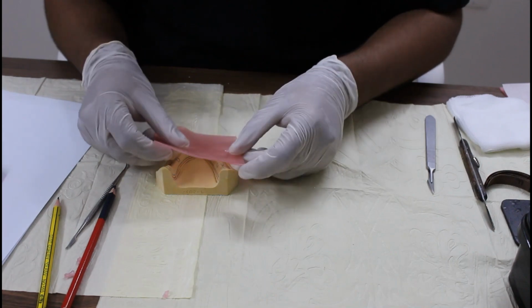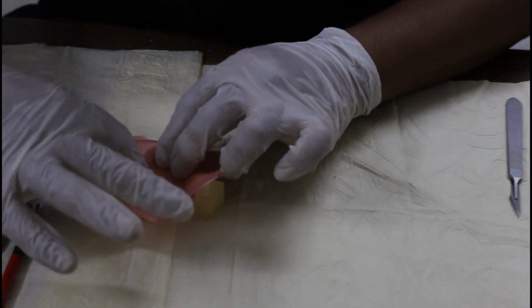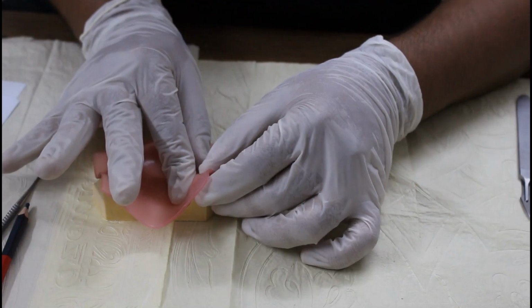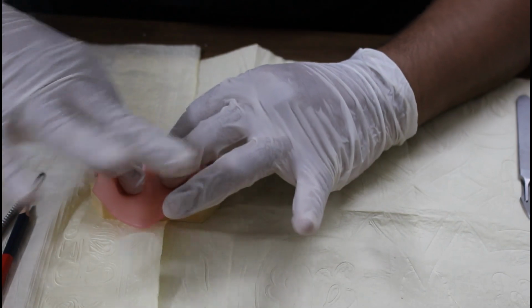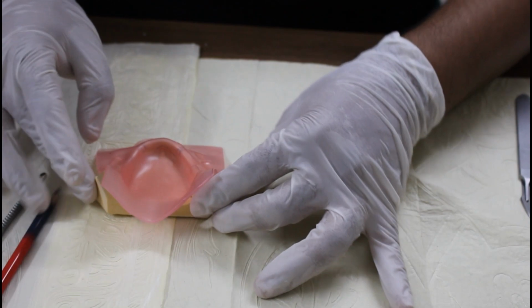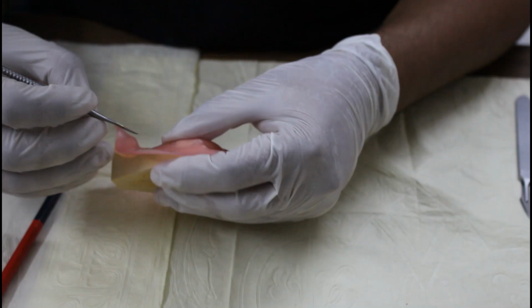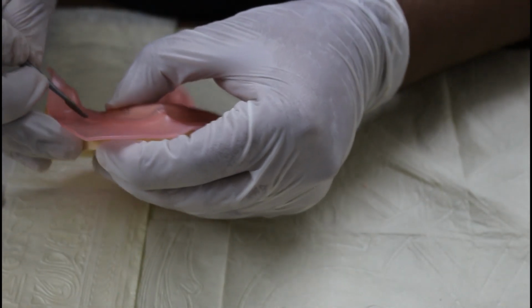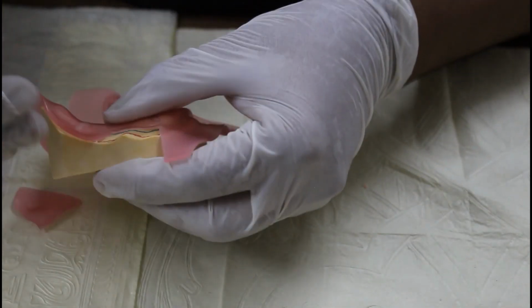Take your cast and adapt it. Do not press too much, otherwise the wax becomes thin in that particular area. You will see it is adapted. You can see the blue color line here. Now cut it. Be careful because the mandibular ridge is narrow, so sometimes the spacer breaks. So be careful when you are cutting it.